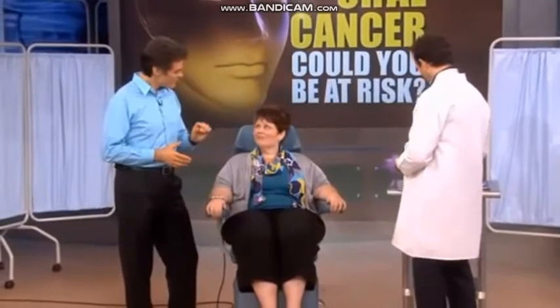Have you ever had a dentist, in your opinion, examine your mouth for cancer? No, because you only get 15 minutes there. All right. When you make your appointment, you have a 15-minute appointment. So I would say no. So I want to change that across America today. So the first oral cancer screening test is something we're going to talk about called the VELscope.